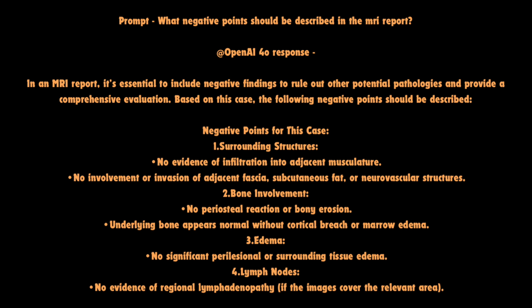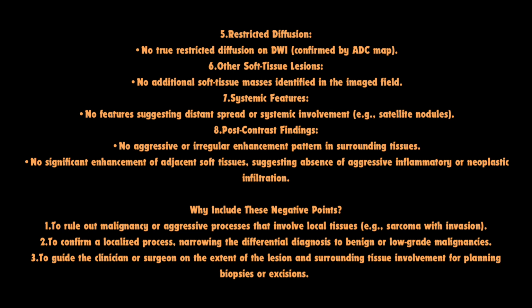Well, think about it like solving a puzzle. Knowing what pieces don't fit is just as important as finding the ones that do. I see. These negative findings helped rule out other possible diagnoses. Yeah, and they supported the idea that this was likely a benign or low-grade malignancy. That makes a lot of sense. It's like Sherlock Holmes eliminating suspects based on what they didn't do. Exactly. So we've seen the AI in action now.